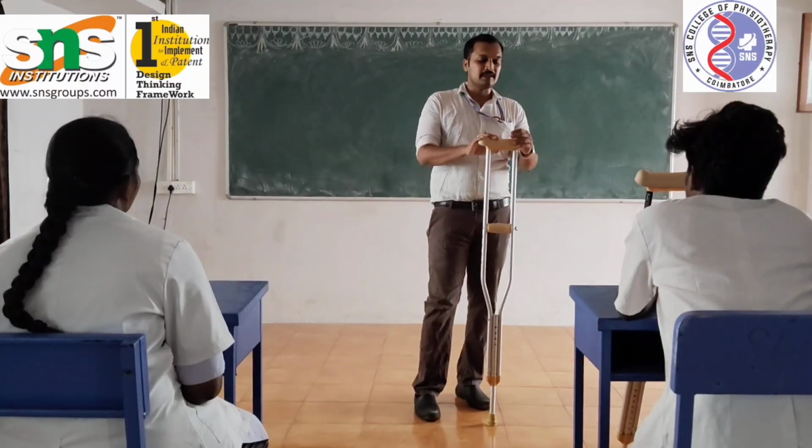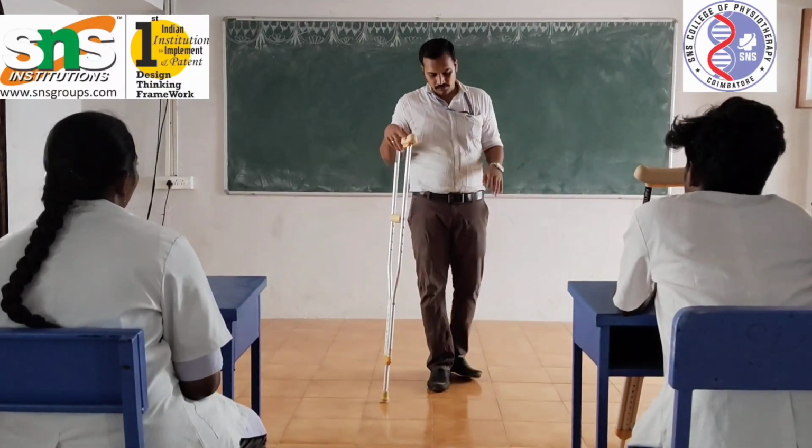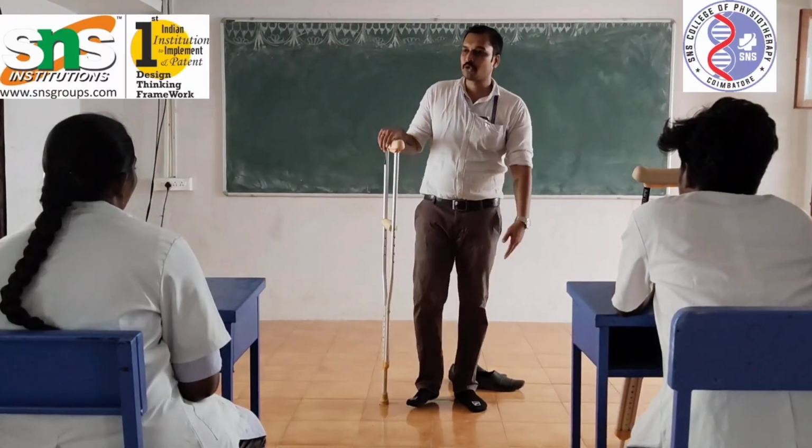Today we will see crutch measurement in the standing position. Okay. So initially we will go with shoes off. We name this type of measurement as shoes off.